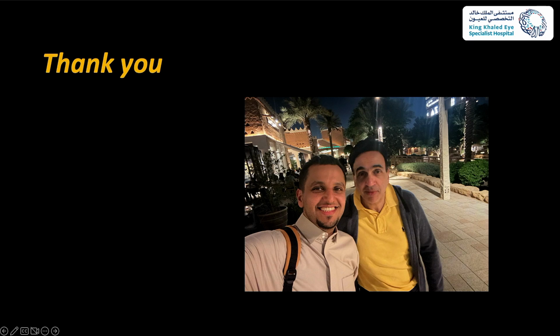I thought of doing this in cases who had lamellar with residual stroma of irregularity, and some of them were post-hydrops, for example, assuming that they had good endothelial cell count, but with a significant irregularity and scarring in the center. So I thought of cutting a disc using the femto laser. Unfortunately, we had the IntraLase, and you cannot do an intraoperative OCT, so I had to rely on the OCT from MS39. And what happened was I cut a nice disc, and I had to go into the stroma to make sure that I include the scarred area and the irregular area.